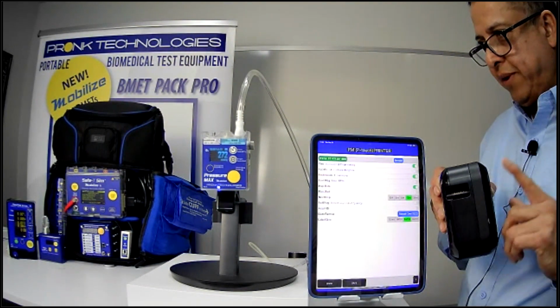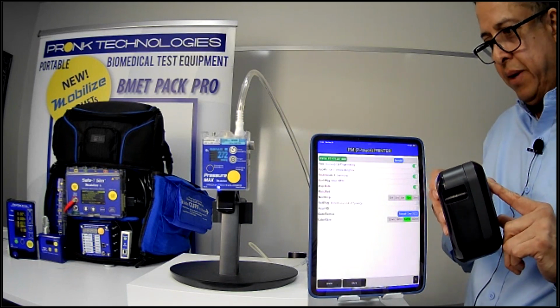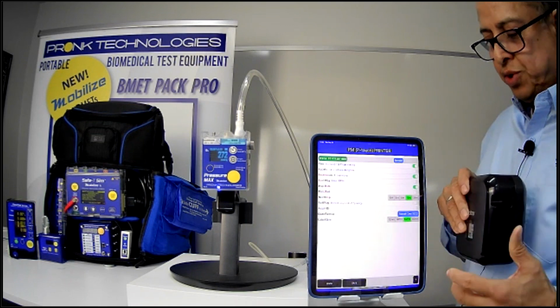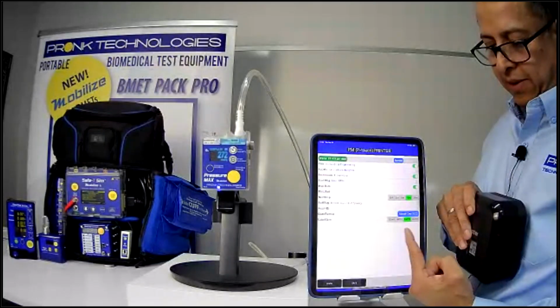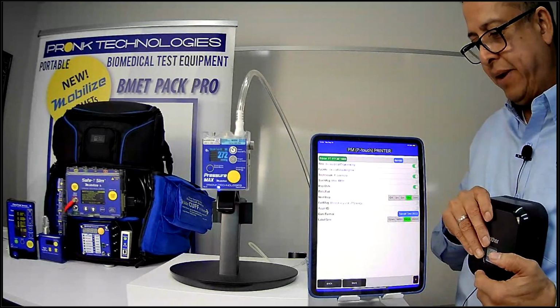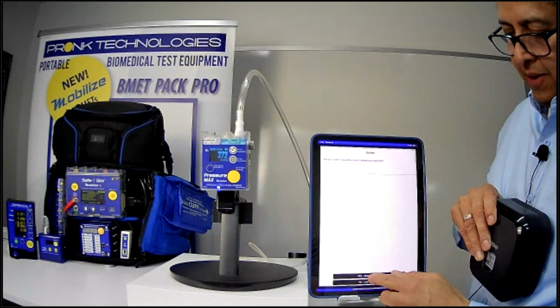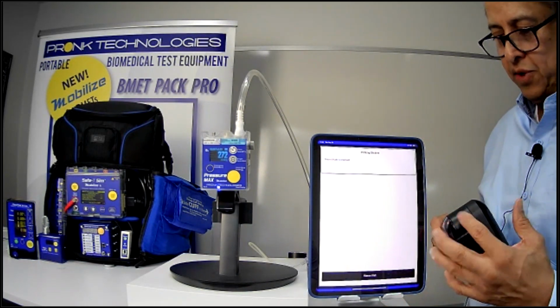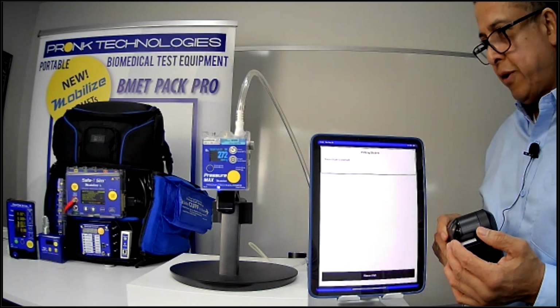The app supports two different kinds of Brother printers. This one utilizes a 24mm label width cartridge, but they also support a second Brother printer. It's also Bluetooth and allows the user to select the length and the width of the tape they would like. So that's why you see those other options there. And I can save these settings, and then I can simply print out that PM sticker onto the label maker. So it's a really useful label maker.